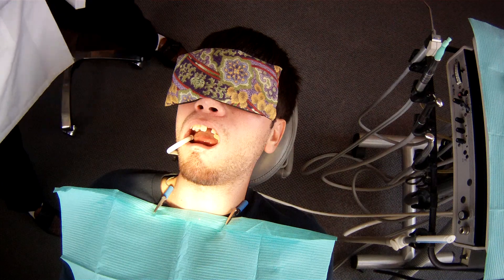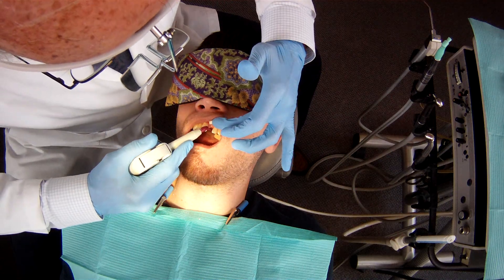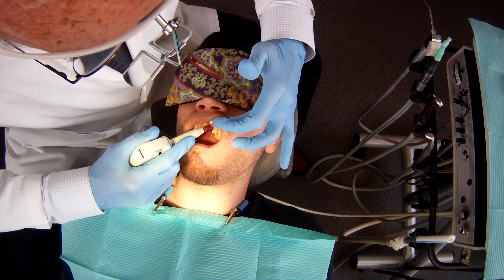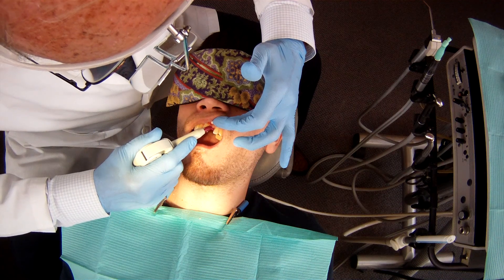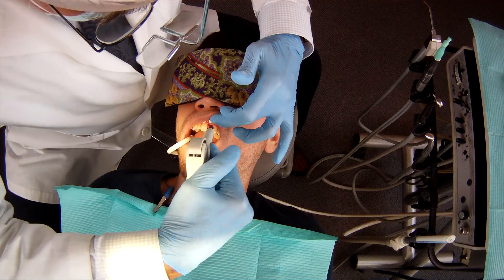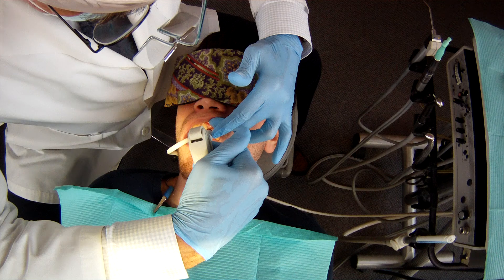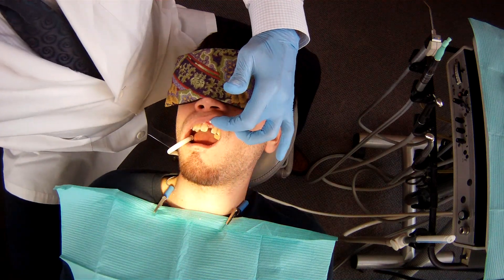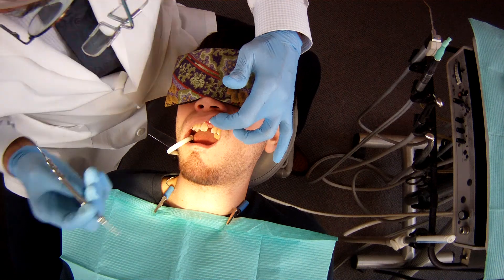So we've treated the enamel of the two support teeth and then I'll be applying this composite to the mesial surface of what we call tooth number 10 and then to the mesial surface of tooth number 8, just like that, and then we'll smooth the composite a bit.